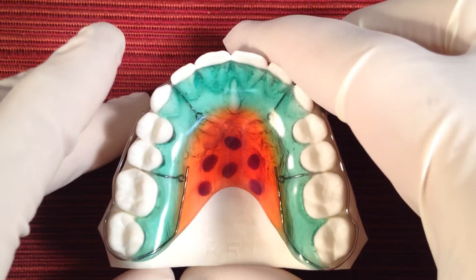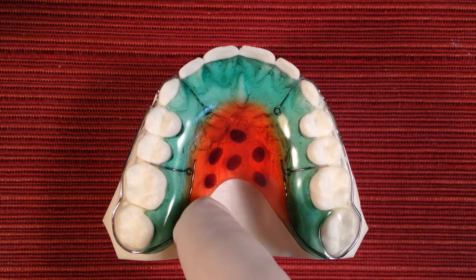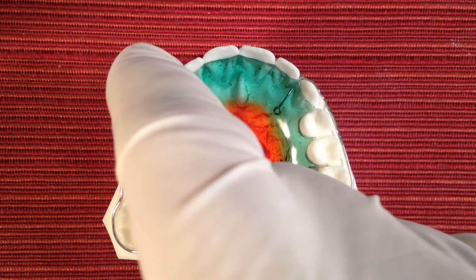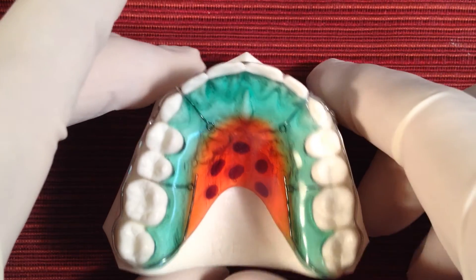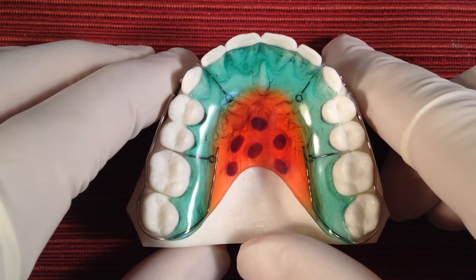There is another type of traditional retainer called the wrap around retainer. The pros or advantages for the wrap around retainer is that it also has that strong durable acrylic plate. Also it only has two very thin wires that go between your teeth that usually your teeth don't bite on at all, or if they do it is only very slightly, so that your teeth most always can fully occlude together. It also holds your teeth all the way around on the inside and all the way around on the outside, which is why they call it the wrap around retainer.